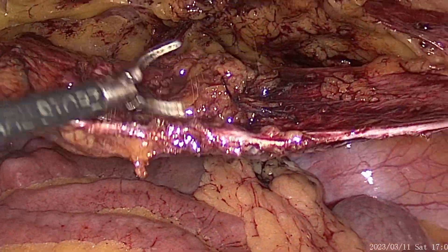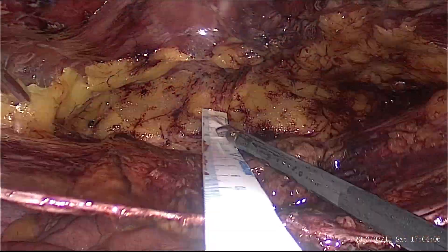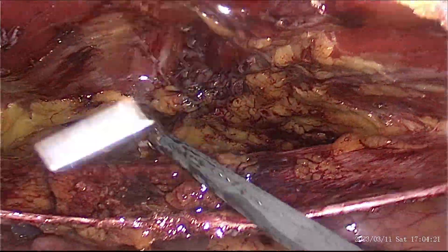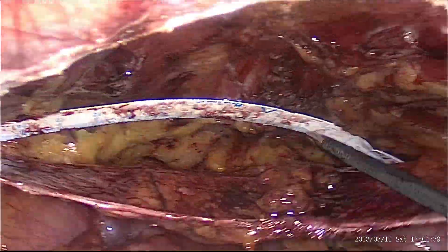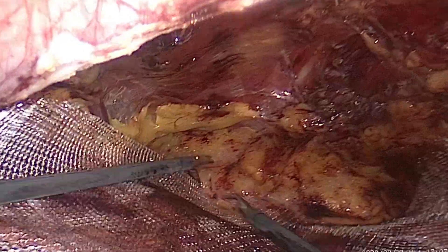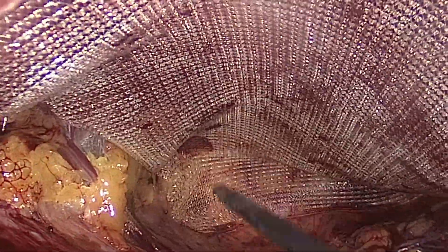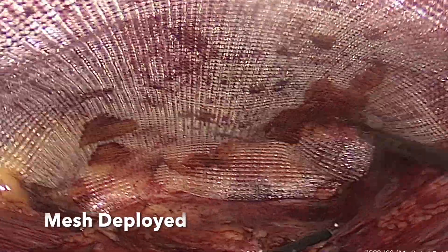After the peritoneal defect closure, the measurements are taken using a ruler. This is a 15 x 13 cm mesh inside the flap, and we were able to cover the defect on all sides by at least 5 cm.